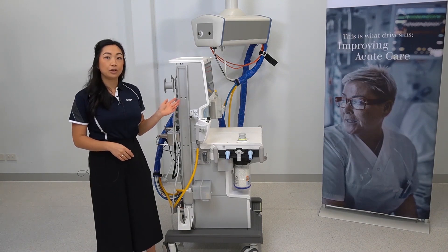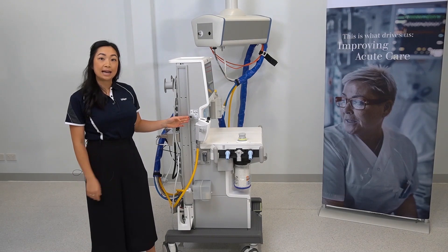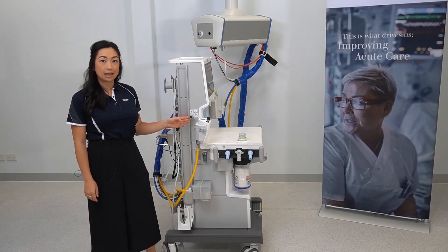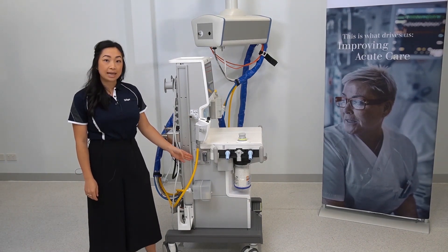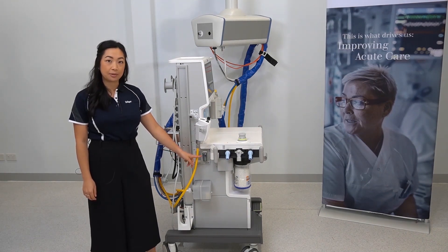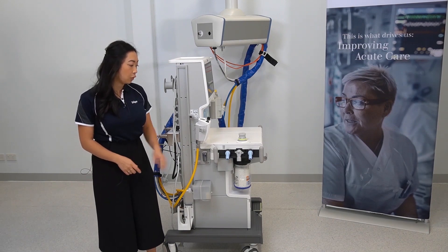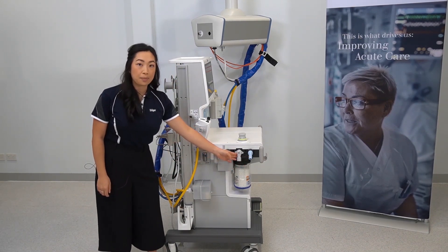This is a side view of the ATLAN A350. Located here is the external fresh gas outlet for your non-rebreather circuits such as the Ayers T-piece. This is where your gas bench would be installed if it's available on your device, and the water trap is located here. As mentioned before, this is your inspiratory and expiratory port and your port for your bag limb.